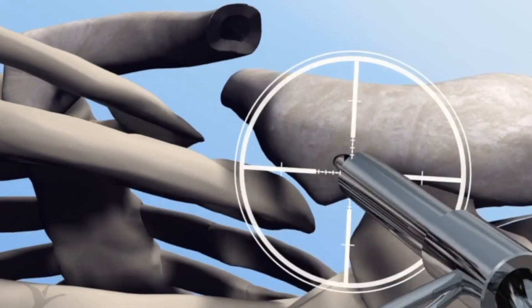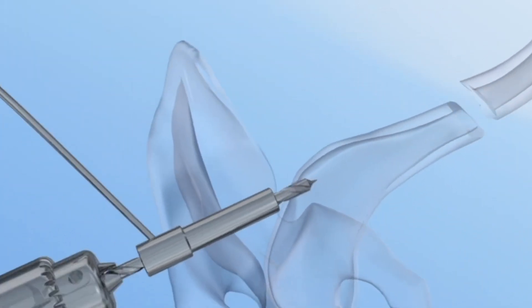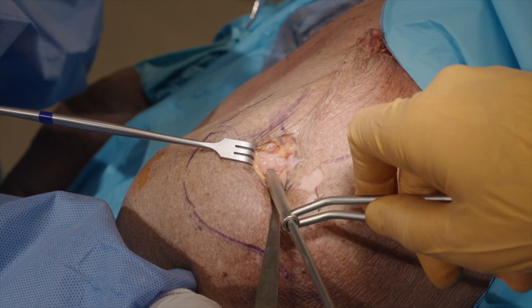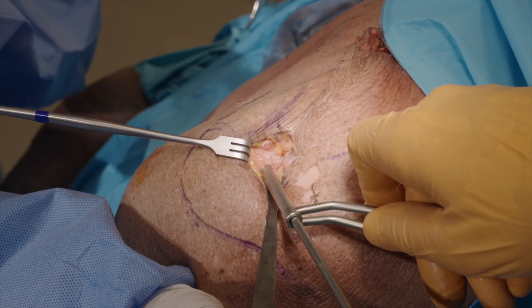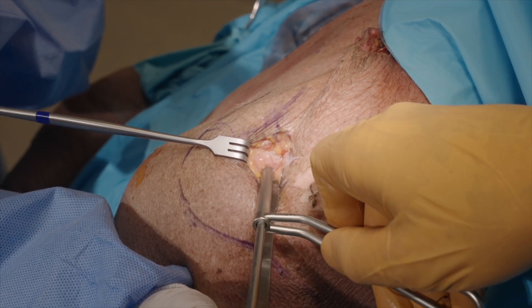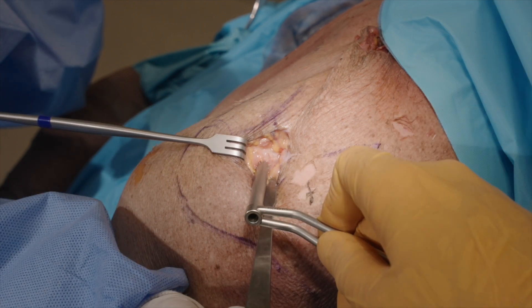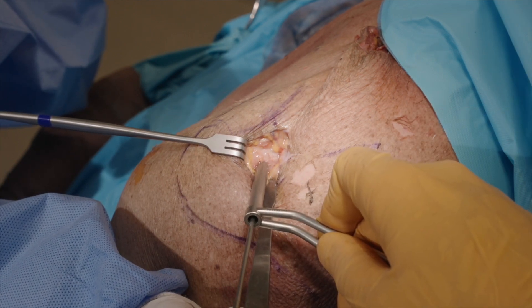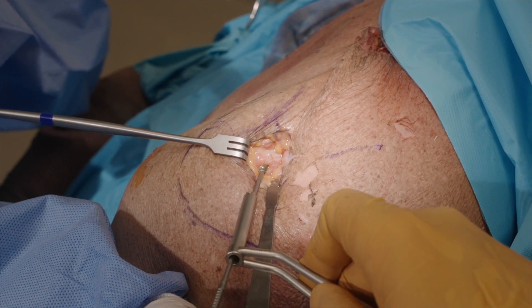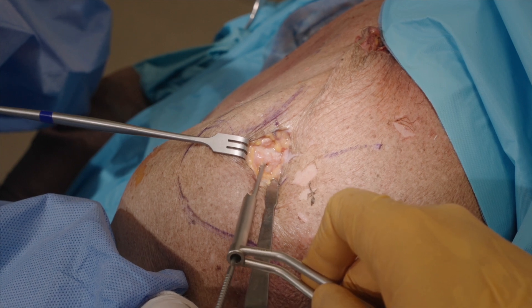If needed, the appropriate entry point can be verified by means of fluoroscopy in two directions. Once at the correct location, drill through the first cortex and enter the medullary canal of the lateral fracture element. Start drilling perpendicular to the primary cortex and slowly adjust the angle of the drill towards the direction of the medullary canal. While keeping the tissue protector in place, remove the drill and use this to place the Anser clavicle pin through without losing the entry point. Next, advance the Anser clavicle pin into the lateral fracture element.